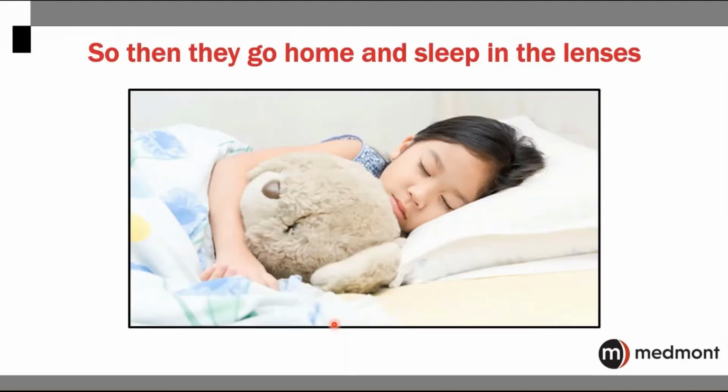So now we're at the point where we have a good orthokeratology fit and we need to send the patient home to sleep in their lenses. And then we find out how they worked.